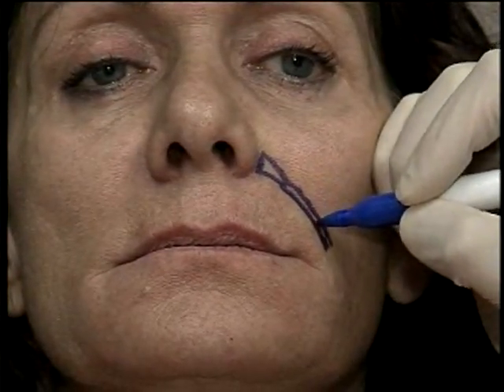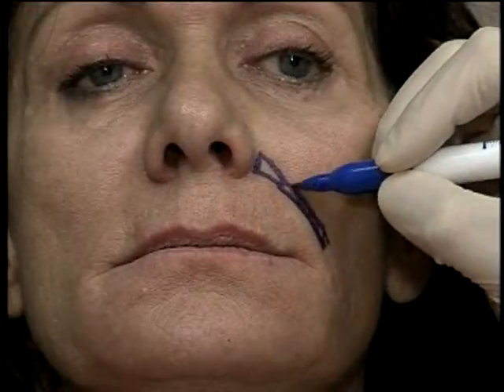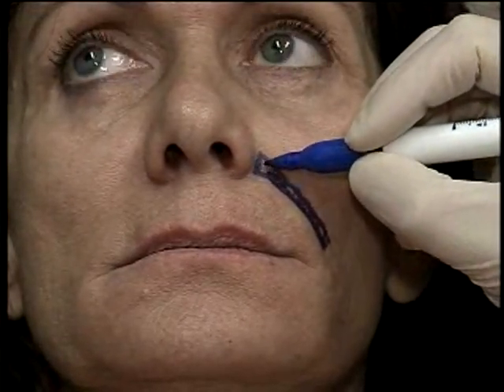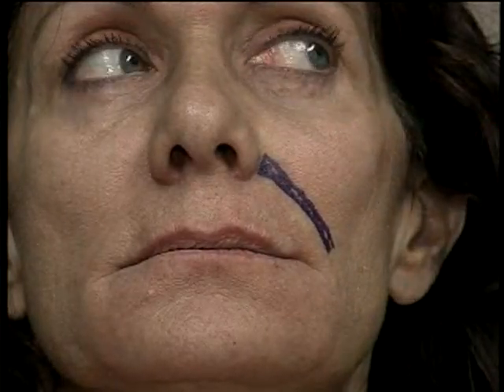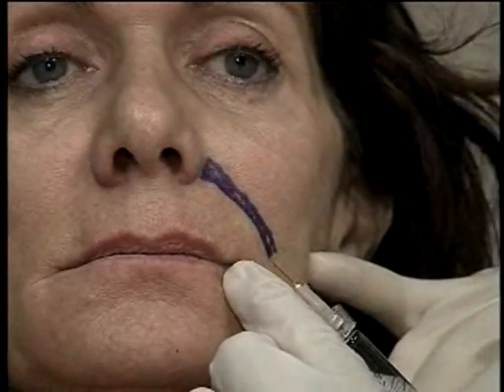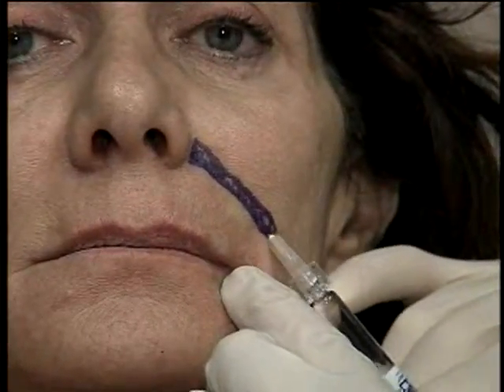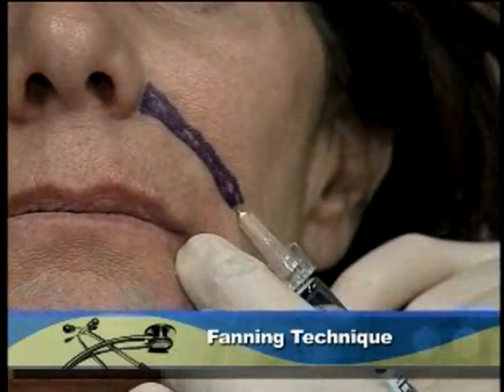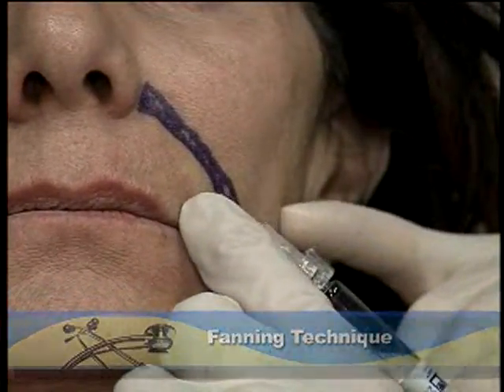So I'm filling in this lane here. That's the area I'm filling in. So I will go a little bit below, and I use a fanning technique. And as I go back and forth, you can see how I'm placing the product in there.